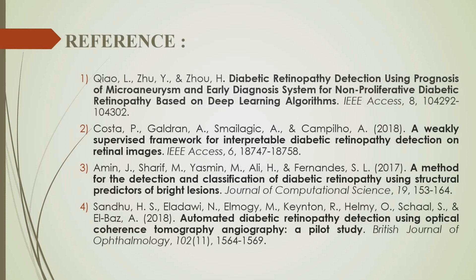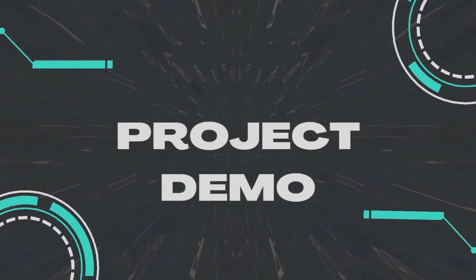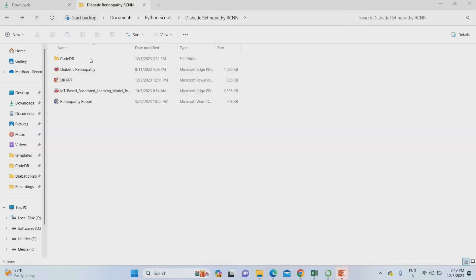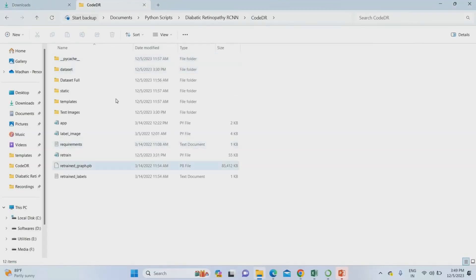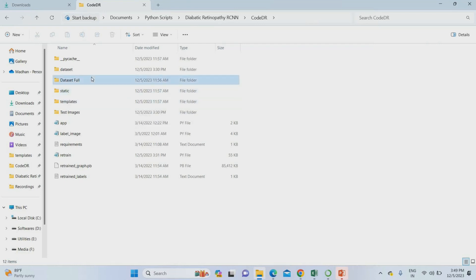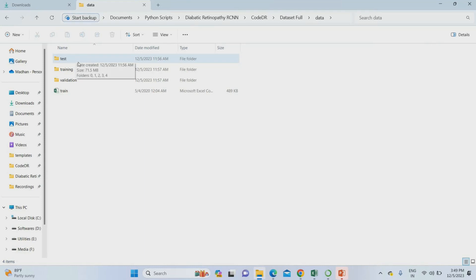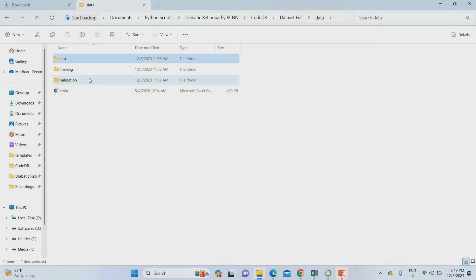Now we move to the demo of the project. To run the demo, we move to the project code folder. The full dataset is divided into three parts: training, testing, and validation, taken at an 80:10:10 ratio.